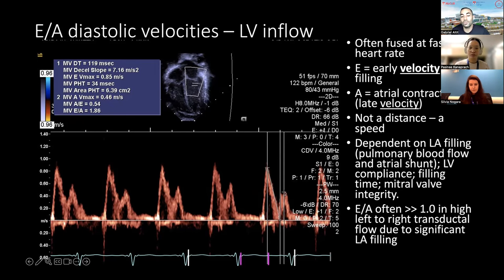Unless your left atrium decompressed via a huge interatrial shunt into the right atrium, right? Then you get less of these velocities. But it's often not the case, right? Most often the premature babies have a tiny PFO, and the tiny PFO can start stretching, but it's not going to be enough to decompress completely the left atrium.